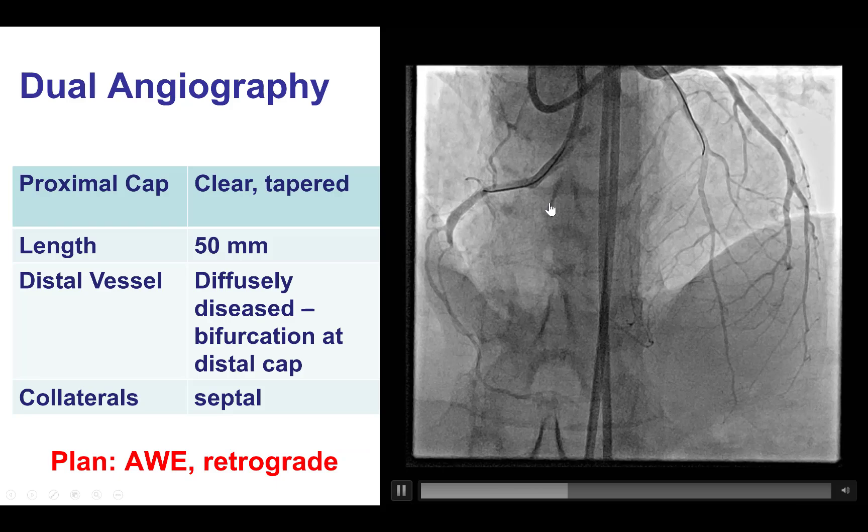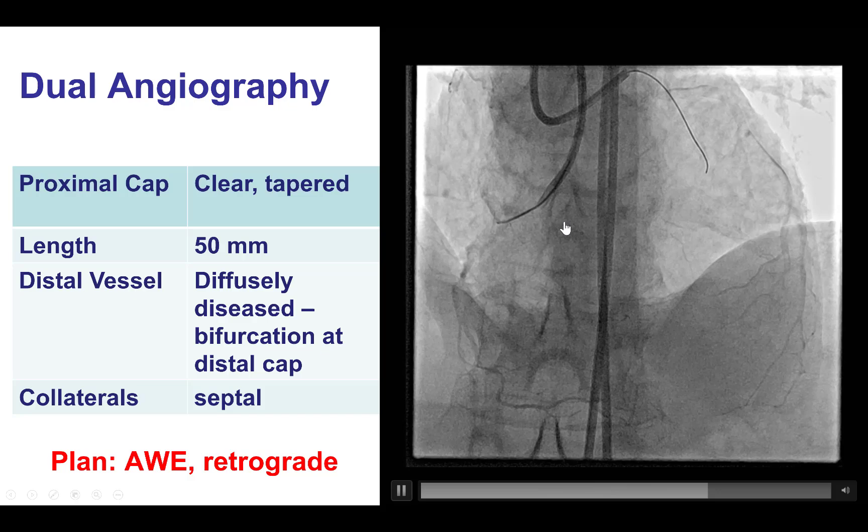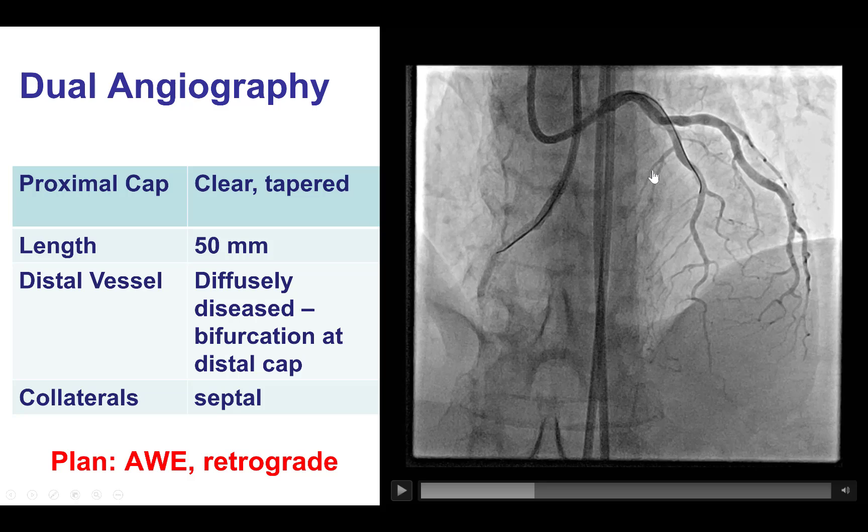Dual injection showed a CTO of the mid-right coronary artery. The occlusion length was about 50 mm. The proximal cap was clear. The distal vessel was diffusely diseased, and the distal cap was at the bifurcation of the PDA and the posterolateral vessel. There were good collaterals from the LAD — the septal collaterals — to the posterior descending artery.